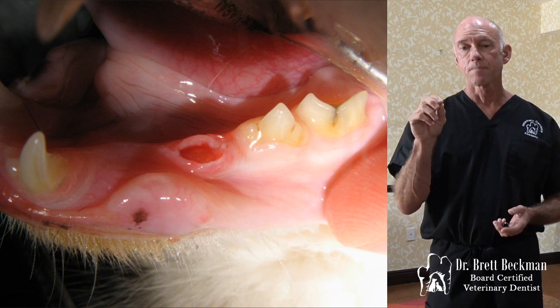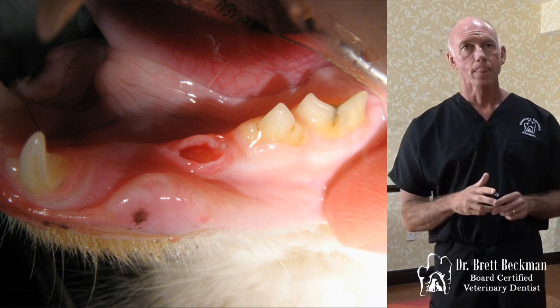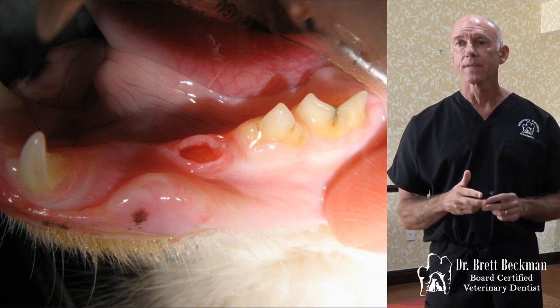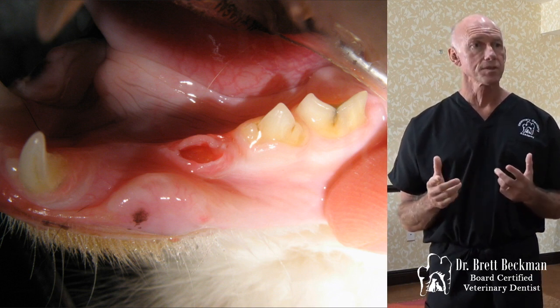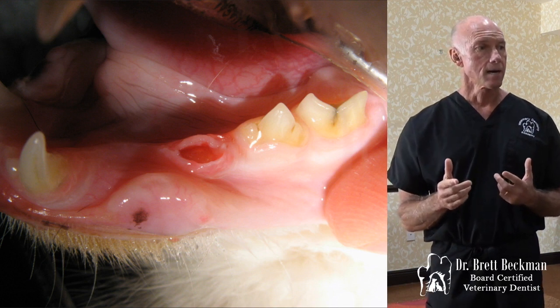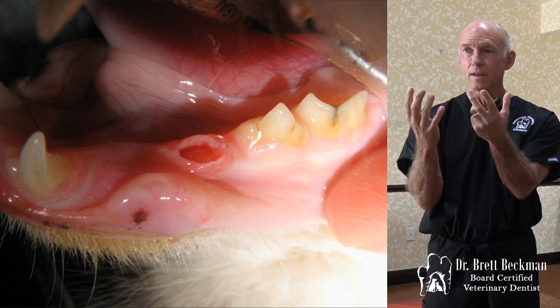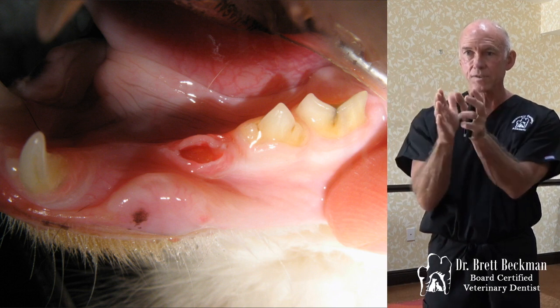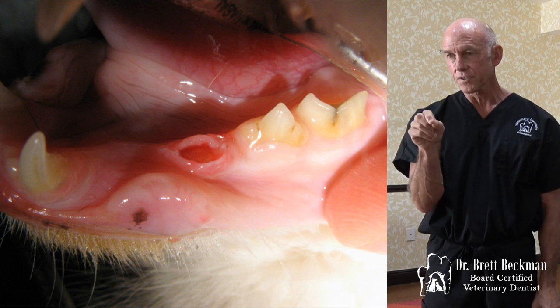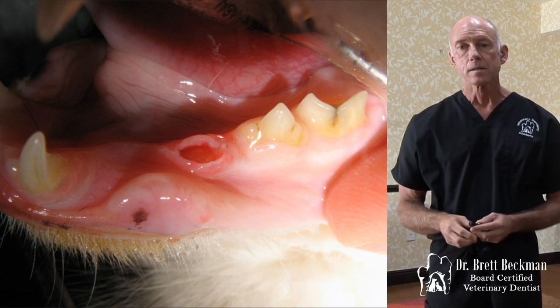They also make a round diamond burr, and a lot of times we'll use cylindrical diamond burrs versus the football burr. You can see the football burr flares out in the center part, but the cylindrical burr is thin, so we can literally see what we're doing on the margins really easily with that burr. So you can use that as well.